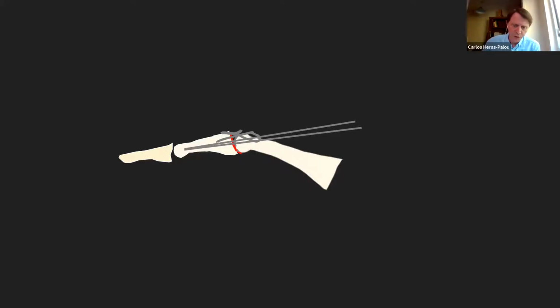So you lift the knot there and you push it into the joint, it doesn't disturb the healing, and the patient cannot feel it. If the patient feels it, it's going to be a bit tender, and then they'll want the wires removed, which means doing another operation. If you leave it all really flat, then it's very rare you need to take the wires out.